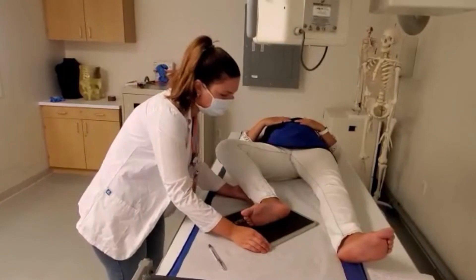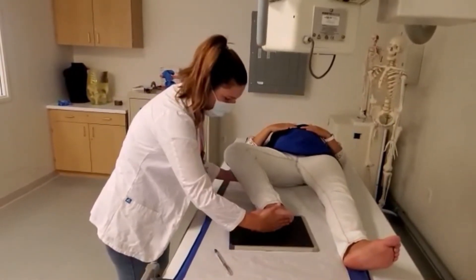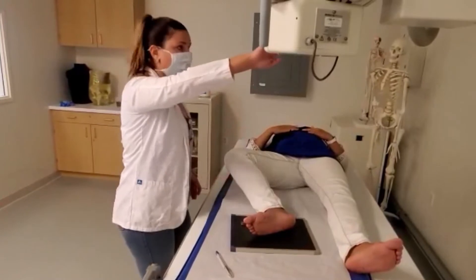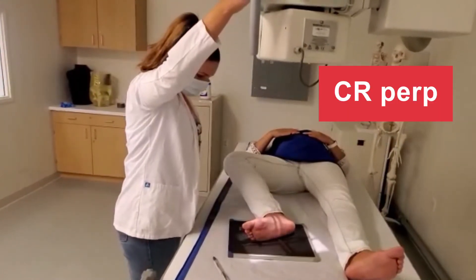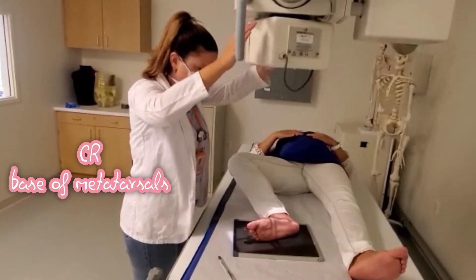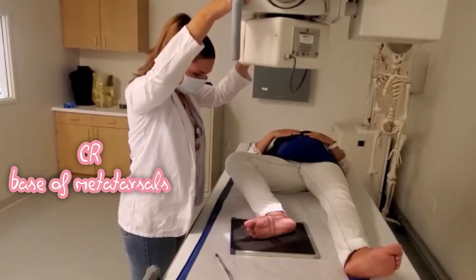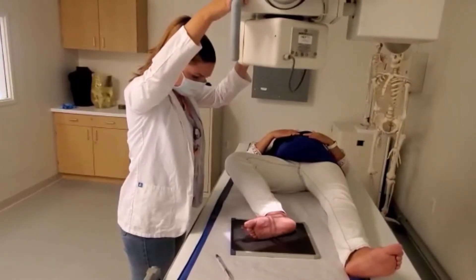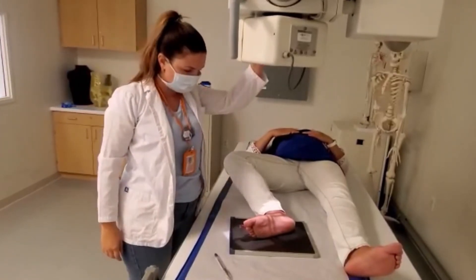You will be using your cassette diagonally if the foot is too large to fit on the IR. We collimate the same way — one inch on all sides.